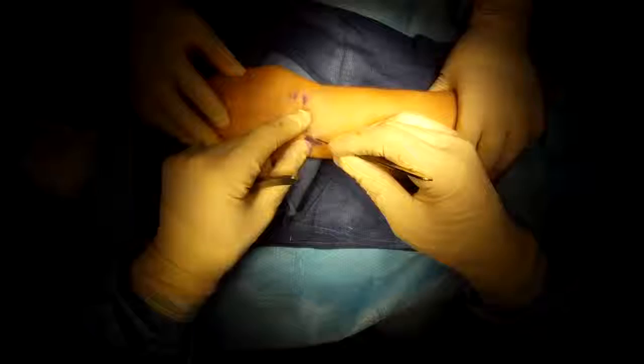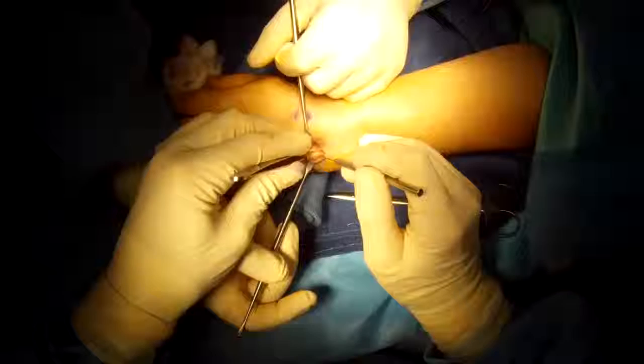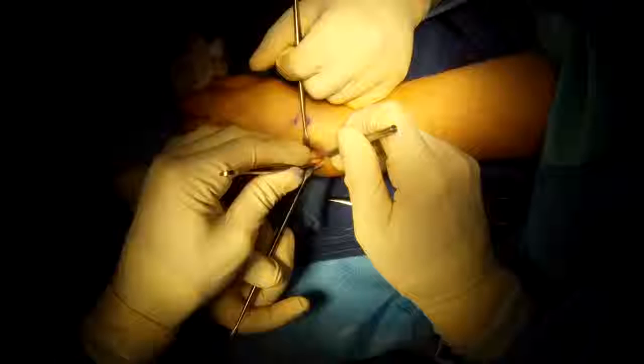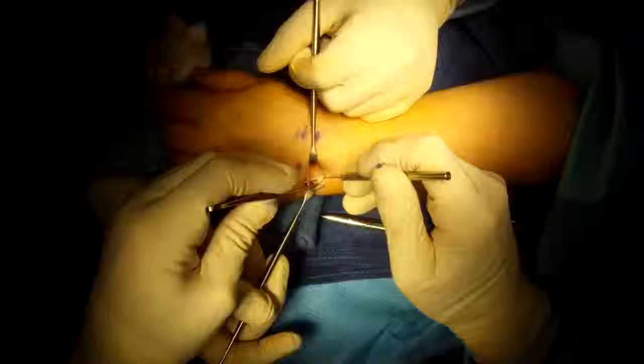Extensor Carpi Ulnaris ECU Tendon Release. The ECU tendon is being pinched in this tunnel, so I make an incision over the tunnel, dissect down to it, cut through the deep layer over the tendon's tunnel, and I come in through the separate tunnel that the tendon is in to release it.